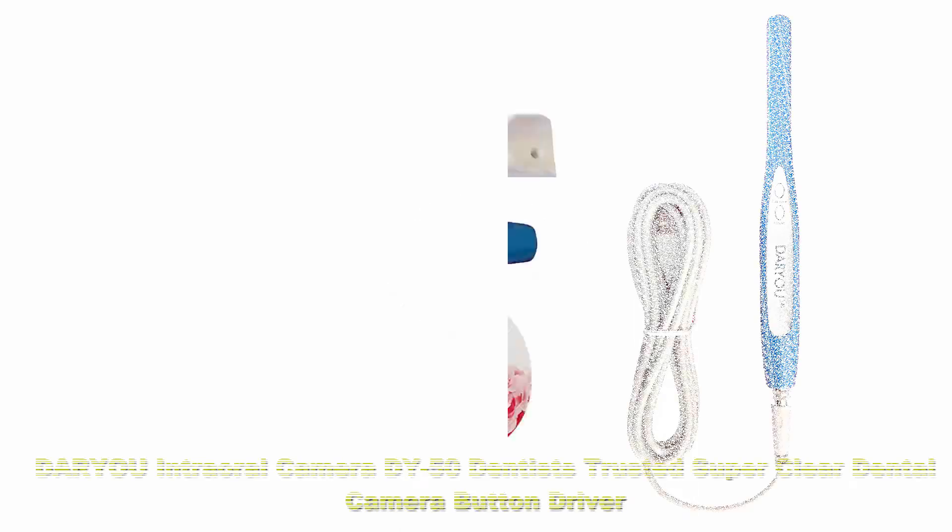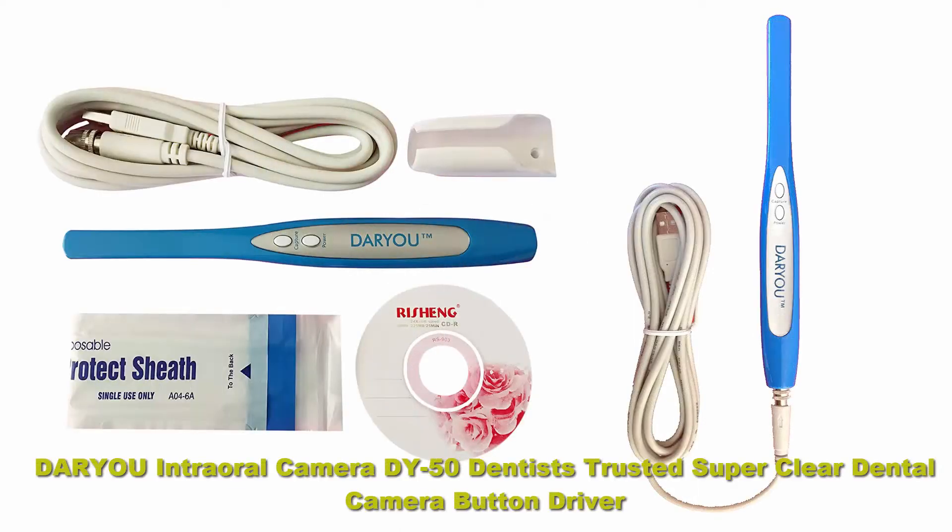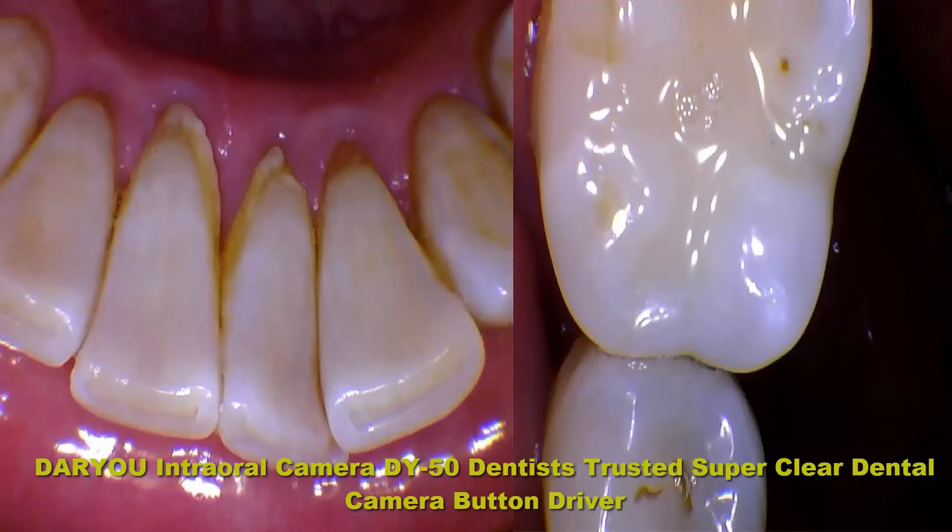Top 4: DARYOU intraoral camera DY50 — dentist's trusted, super clear dental camera. Button driver included, works with Eaglesoft, Dexis, and more.